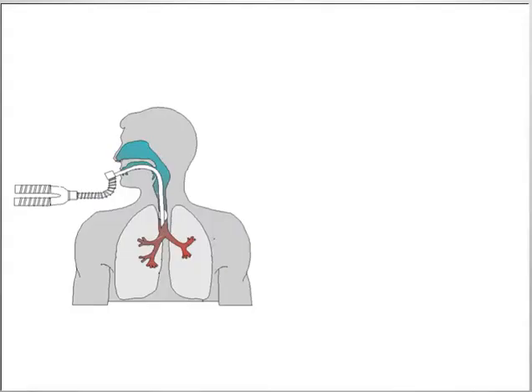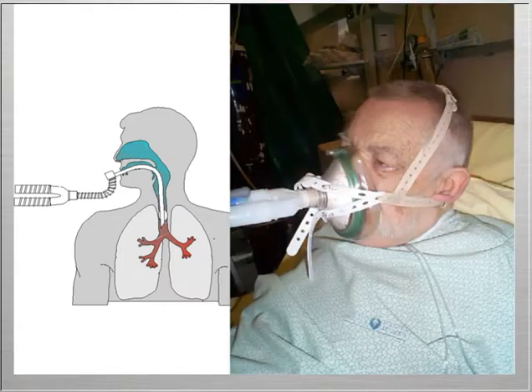The general principle, as I'm sure you all know, for non-invasive ventilation is to avoid the need for endotracheal intubation, which is the classical way to have access to the lower airway in the intensive care unit. Therefore, non-invasive ventilation should be applied at a time where the patient does not yet need the ventilator, so before. For instance, we may decide if Marco Ranieri's condition worsens, whether he needs non-invasive ventilation now before being intubated tonight.